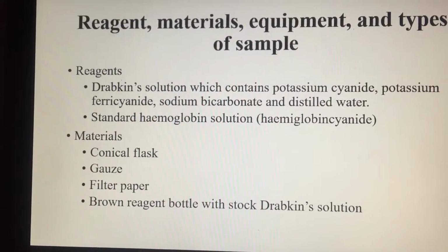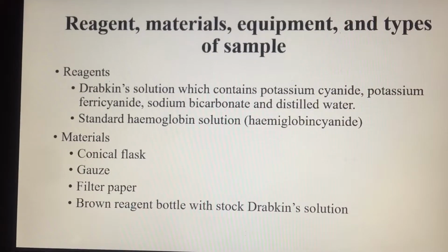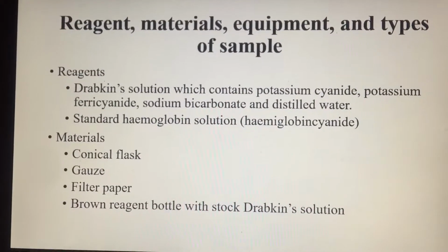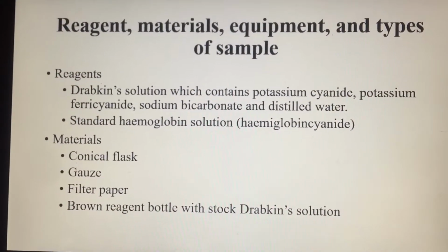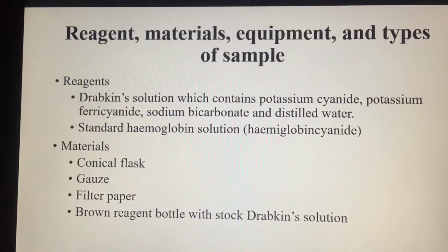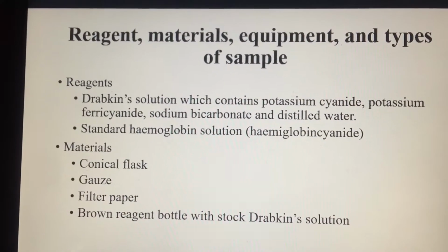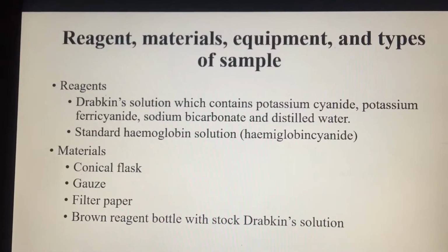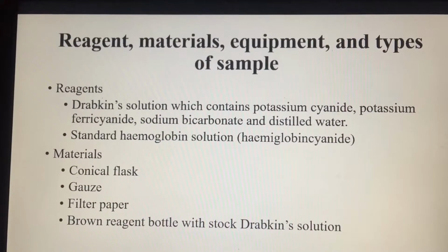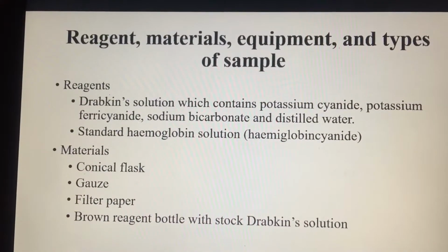In the reagents, first we have Drabkin solution, which contains potassium cyanide and potassium ferricyanide, also sodium bicarbonate and distilled water. So that is the ingredients of Drabkin solution.